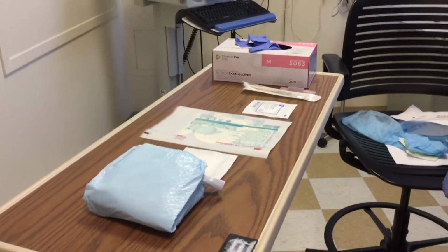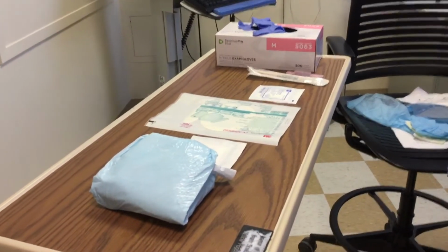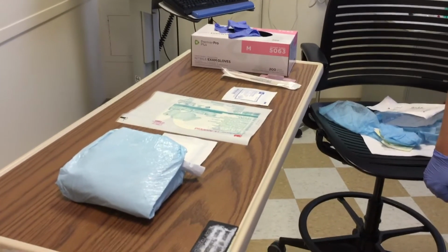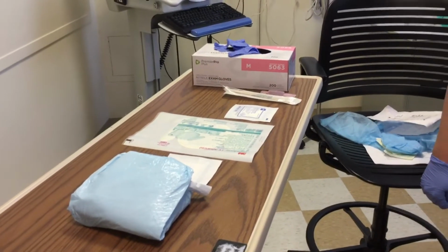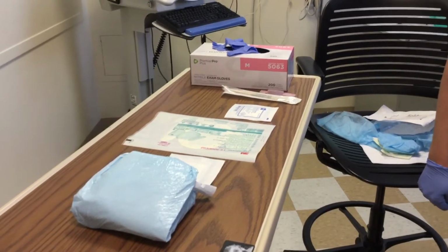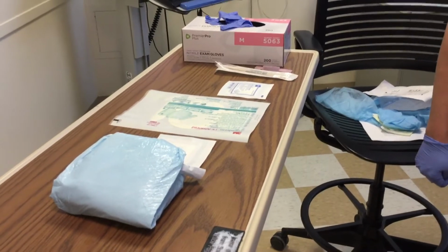Make sure that your door or curtains are closed around the patient's area. You're going to cleanse your work surface with Cavi wipes or the hospital approved cleaning wipes and allow it to dry. You're going to open your dressing change kit, apply hats and masks to whoever is in the room. You may need to grab more if not enough are in the kit.